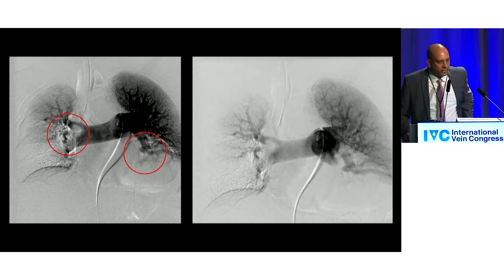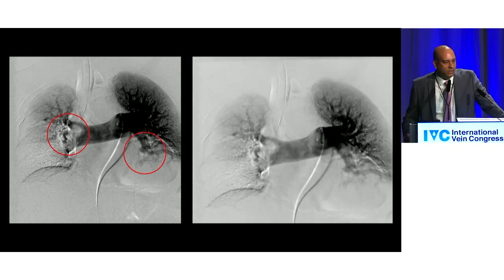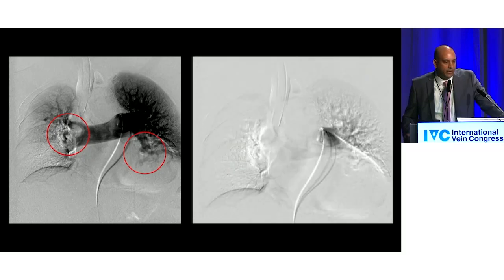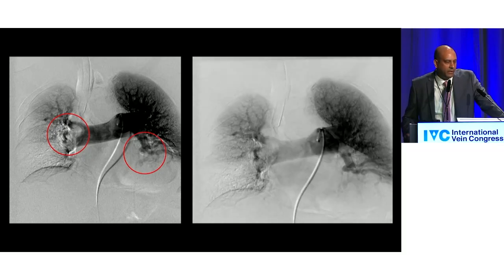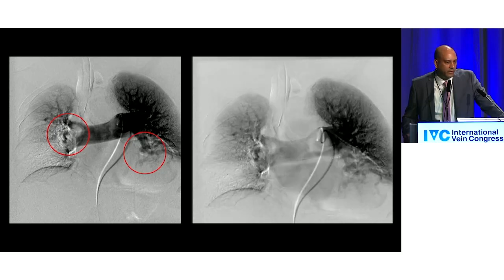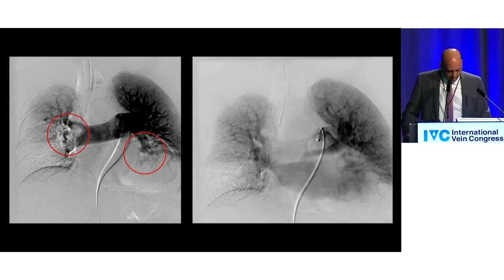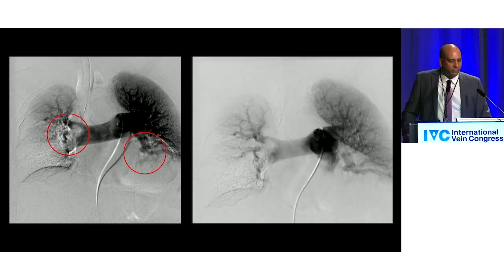And here's an example of that. Here's another patient, submassive PE. You can see this patient's not doing as well. They're intubated. They've got pretty extensive clot in that right PA, which is really giving very little flow to the right lung. And then you can see on the left side, the descending branch of that pulmonary artery is pretty blocked and occluded as a result of clot.